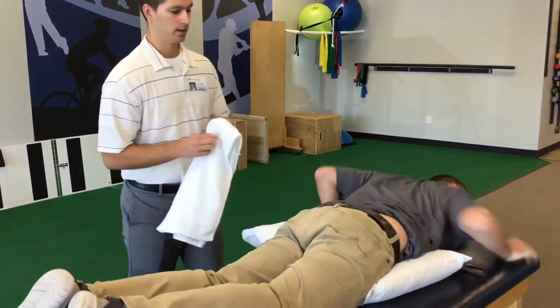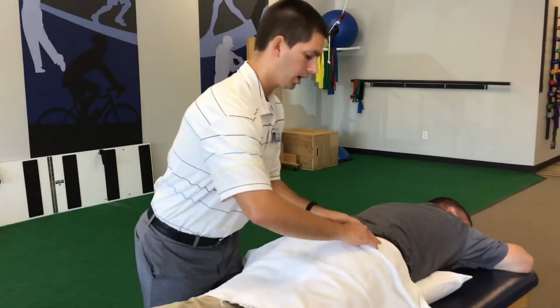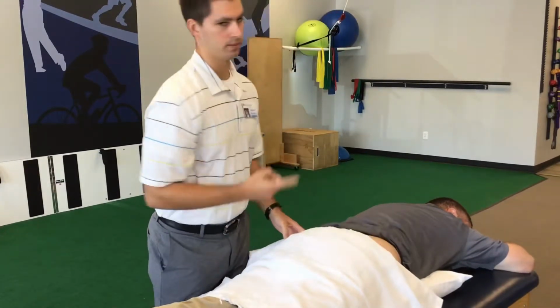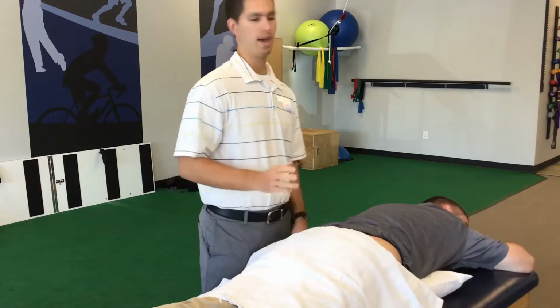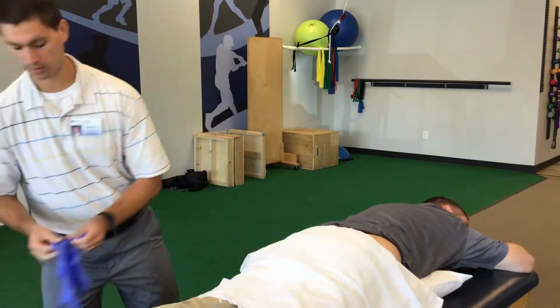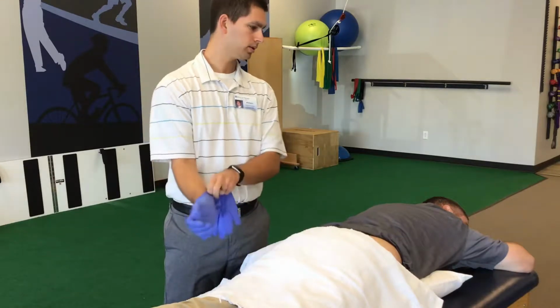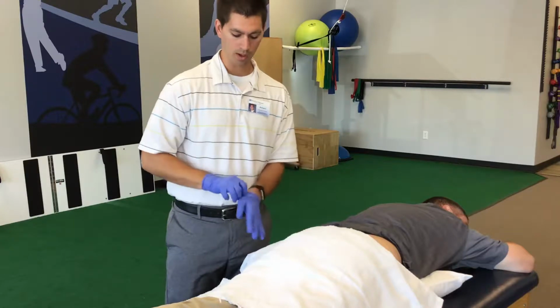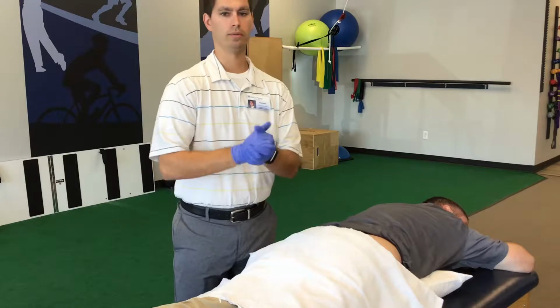All right. And so what we would do if you were a patient who was coming here for treatment, we would obviously do a consent form. We'd do a thorough evaluation. We wouldn't just pop up, hey, yeah, your back hurts, let's do some dry needling. So Josh is a physical therapist, so he knows what to expect, kind of knows what dry needling is. Josh also does dry needling, so he's done this to multiple people. And so we go through evaluation. We make sure that it's an appropriate tool for the patient.